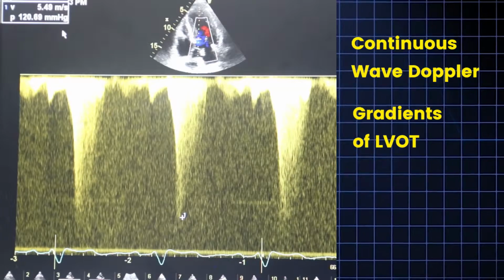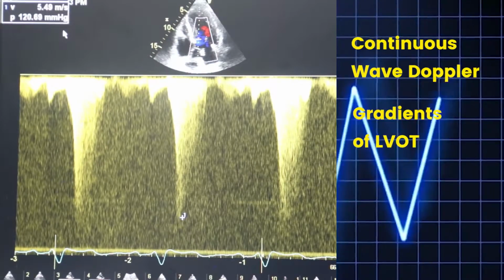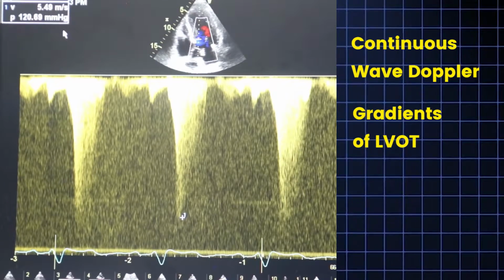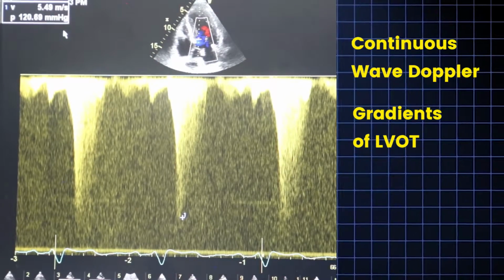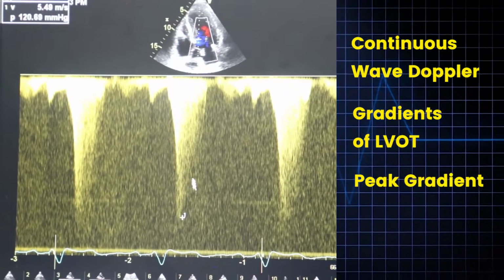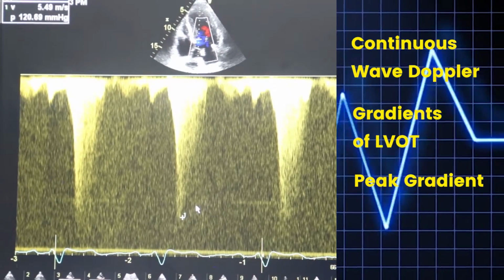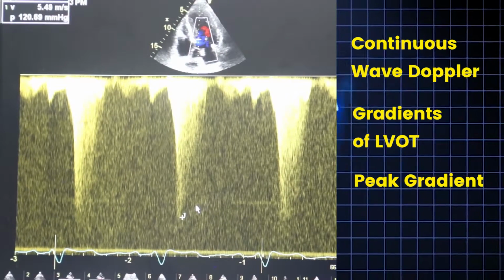Remember that 1/3 of patients will have hypertrophic obstruction without provocation, 1/3 will have a provocable gradient, and 1/3 will have non-obstructive HCM. Report only the peak gradient. We don't need to see the mean gradient, that's not relevant, and rule out any other causes of LVOT obstruction, including subaortic membrane.